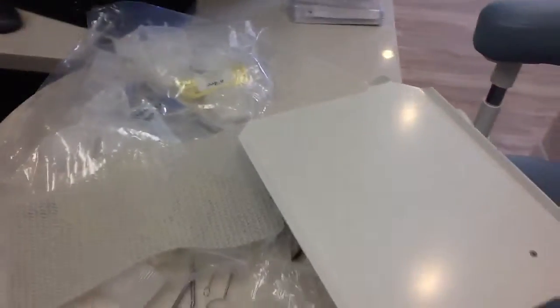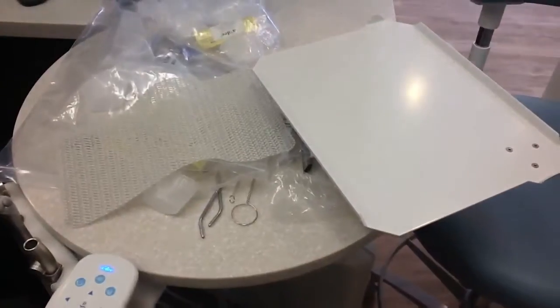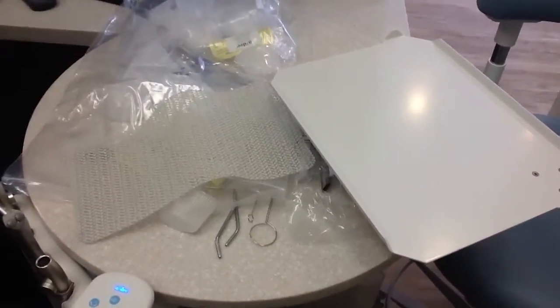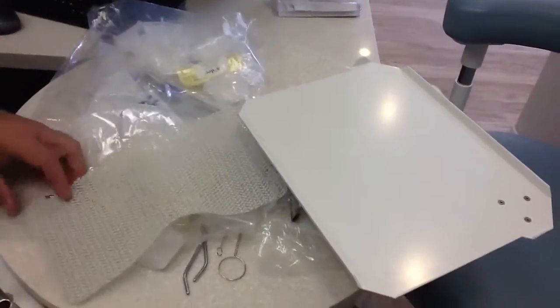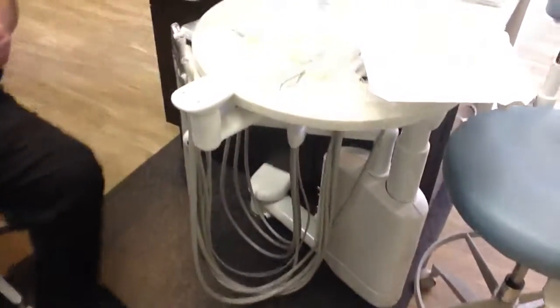I'd never thought of the keyboard, but that's really handy for an assistant to be able to type and look at the monitor at the same time. Well, and it takes it off of the main working area as well. Okay. Little something extra there. Alrighty, so I've learned more than I ever thought I would.